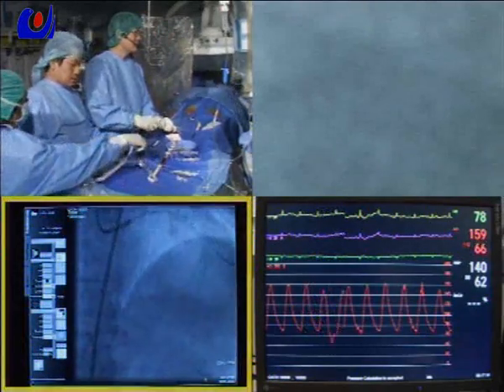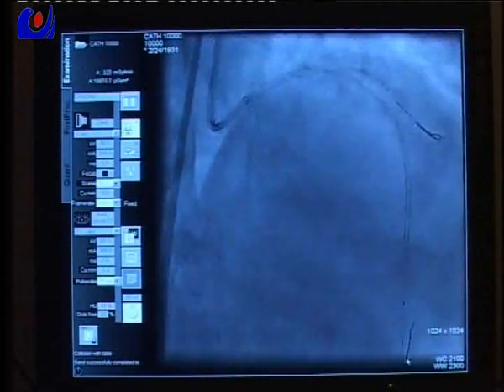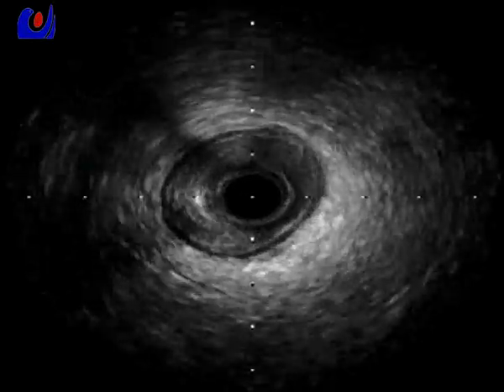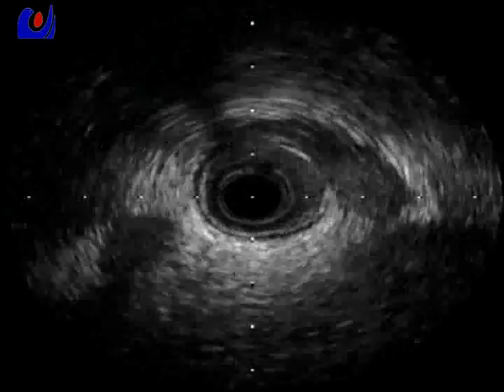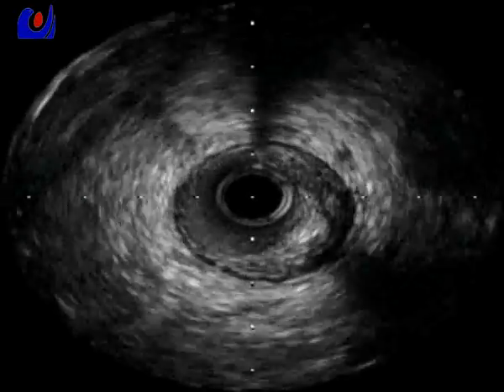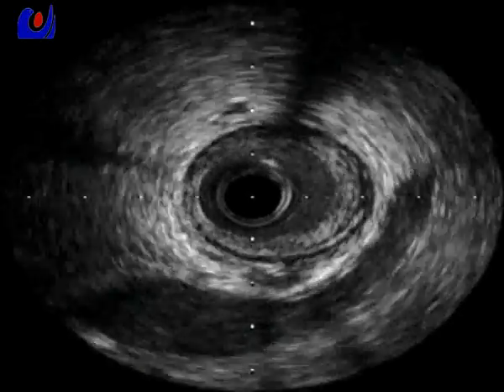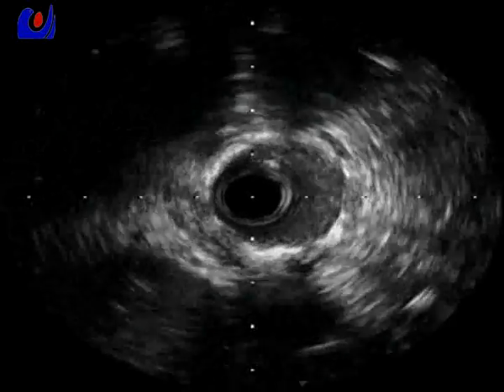So you can watch, I'm moving my IVUS catheter quite easily. Now we are passing through the original stent lesion. Okay, pull back please. Okay, IVUS starts from here. This is already the mid portion, quite far beyond that stented portion. So I'm pulling back a little bit. Hopefully the patient doesn't have to tolerate too long a procedure. And so we can see here, there's a lot of plaque. The media to media is almost like 3. Then the original stent here is only about 2.5.